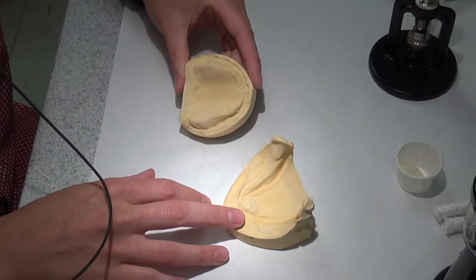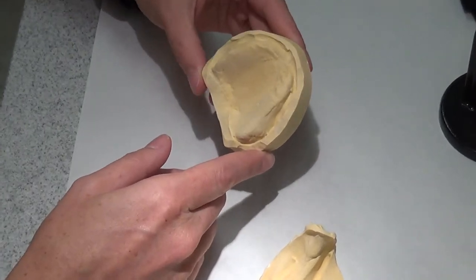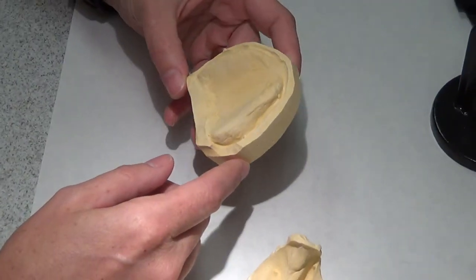Custom trays for the edentulous patient. So this is an actual patient of mine that I am treating in faculty practice.